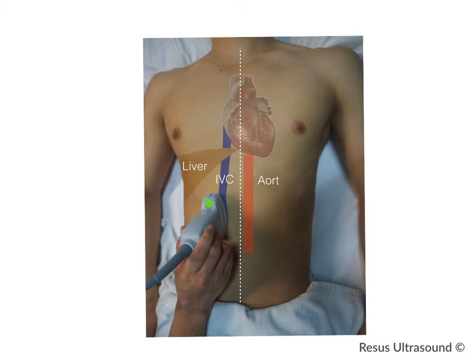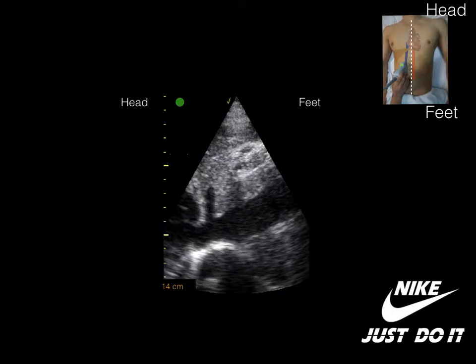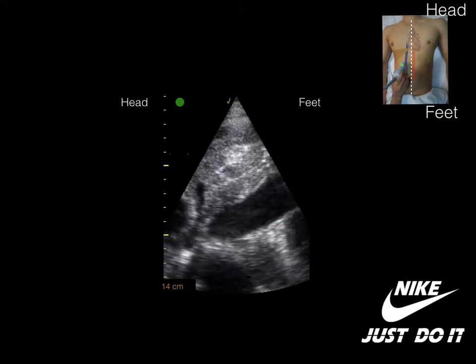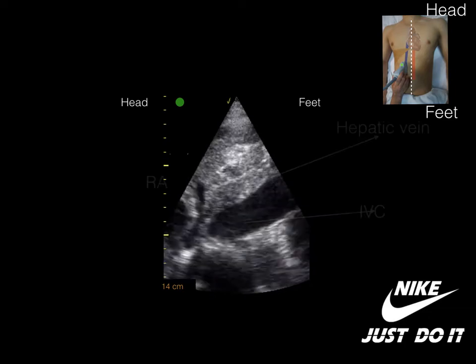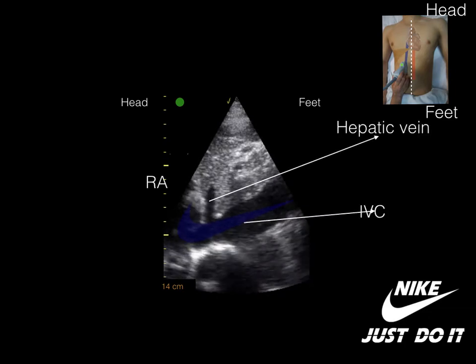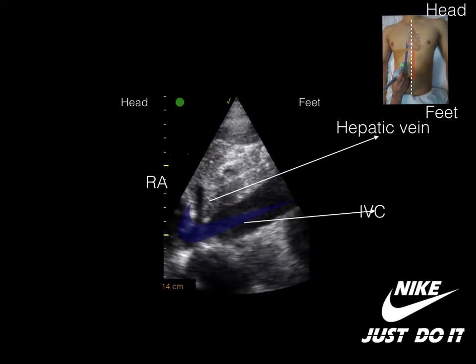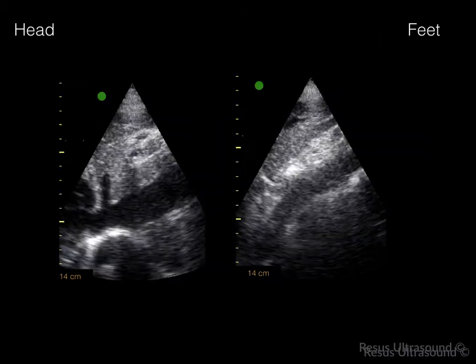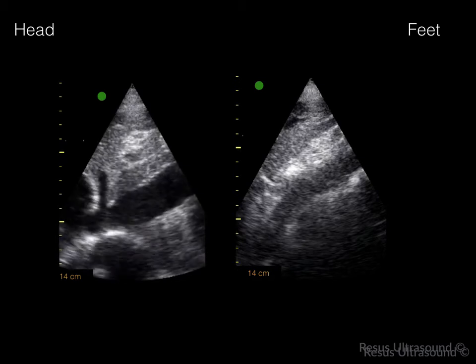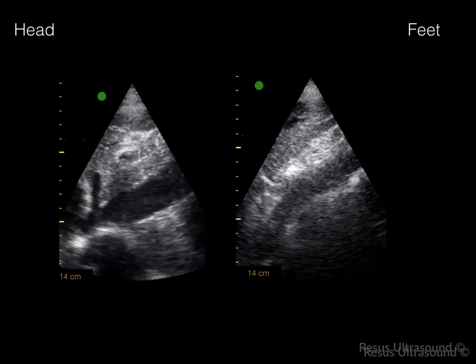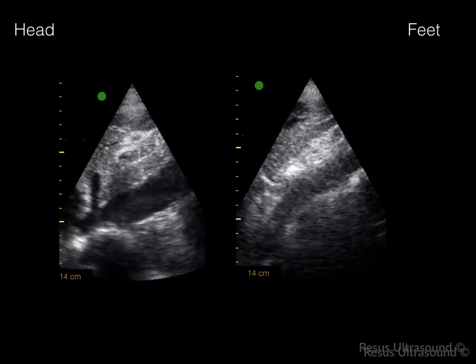To do IVC ultrasound, put your abdominal or echo probe a little bit right of the midline of the patient. The marker should be toward the patient's head, as shown in the green circle. You will see a black tube which varies by respiration — it looks like a swoosh, a checkmark, or a Nike logo. This is the IVC, and there is a hepatic vein draining in also. Sometimes you confuse IVC with the aorta.